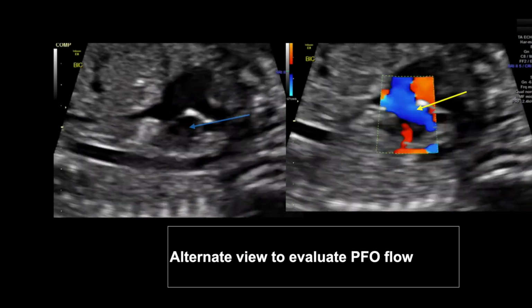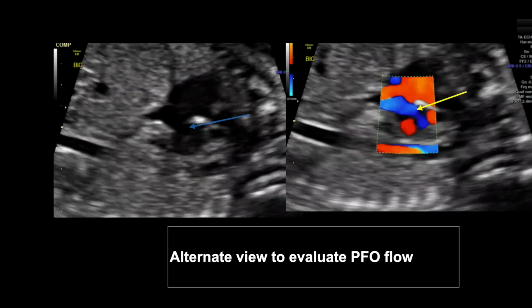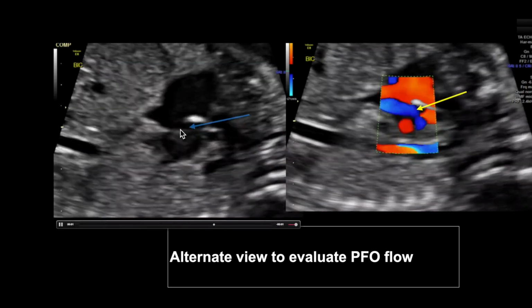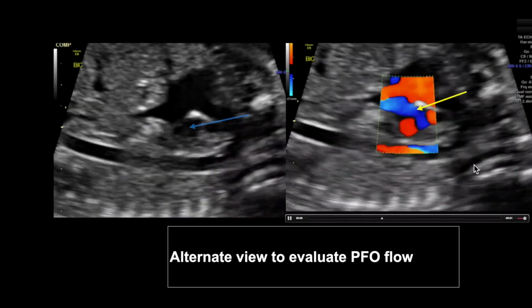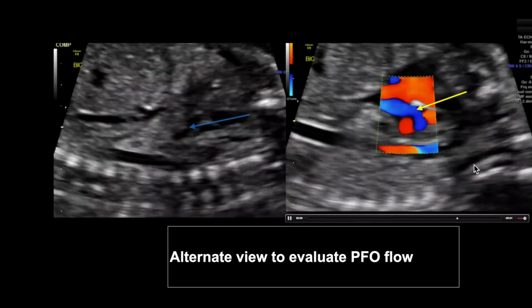And as I mentioned, this is another place where we can also look at the foramen ovale flow. We can see really nicely here how it's going from right to left and track it into that left atrium. So this is a really nice plane, especially if you're worried about it. I would definitely be looking in this plane as well.